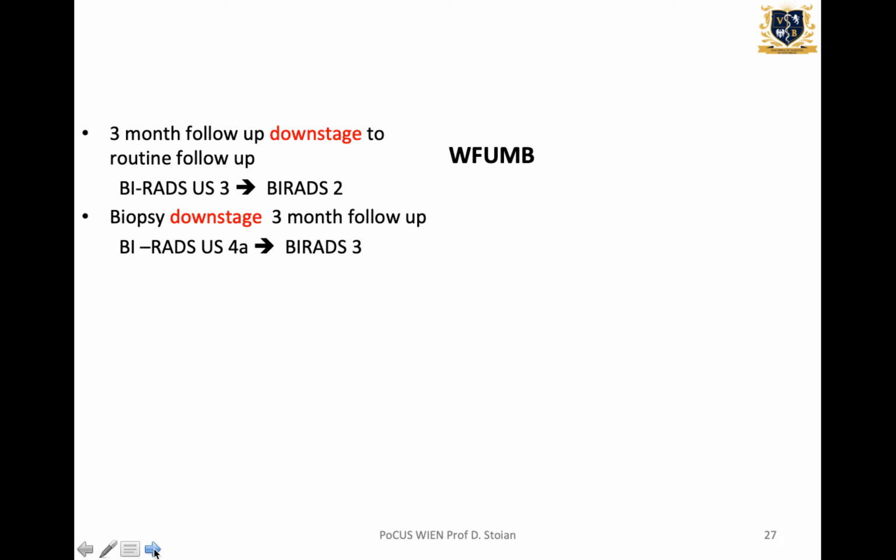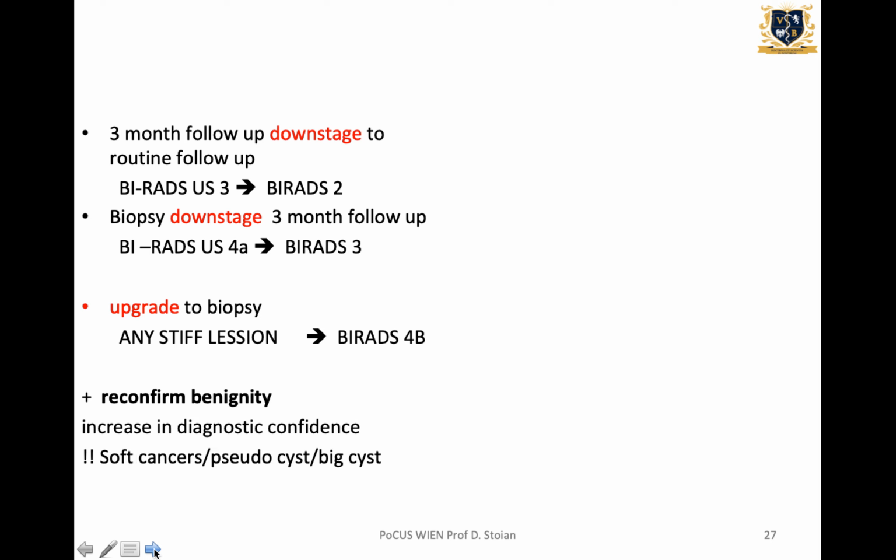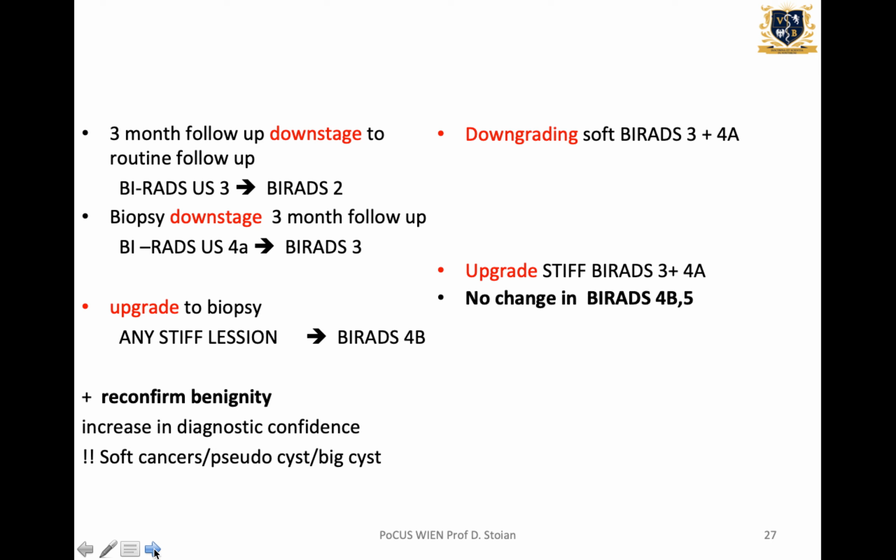Downstage 4A to 3 whenever the lesion is soft. Upgrade to biopsy any solid lesion which is stiff. And of course reconfirm benignity in BIRADS 3 which is soft. What says the World Federation recommendation? Downgrade soft 3 and 4As. Upgrade whenever you see solid stiff lesions.